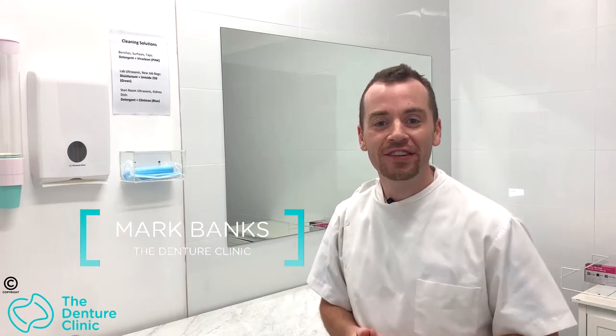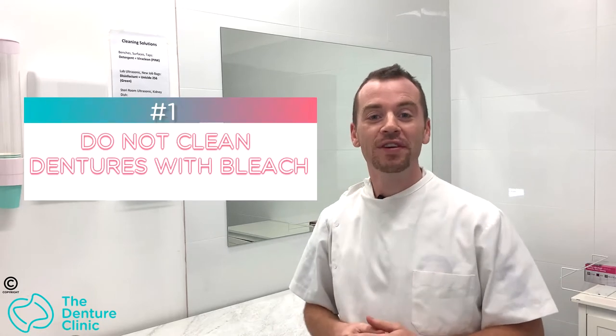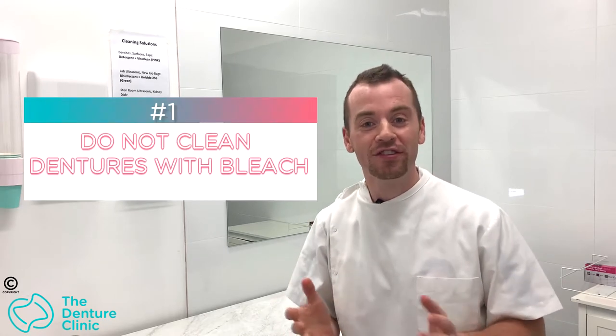Hi, my name is Mark Banks and I'm the owner of The Denture Clinic. I wanted to let you know seven things you should not do to your denture. The first thing you should never do is clean your denture with bleach.